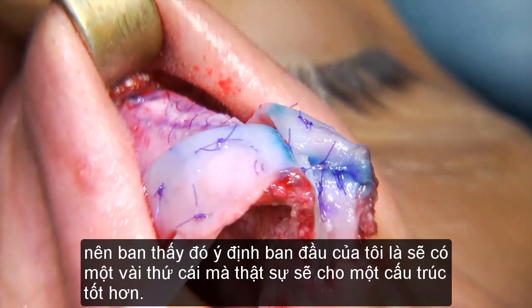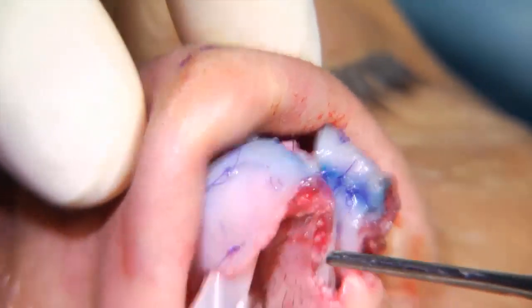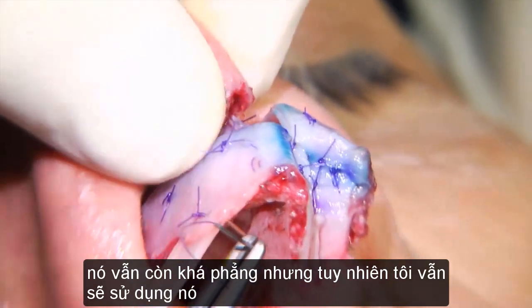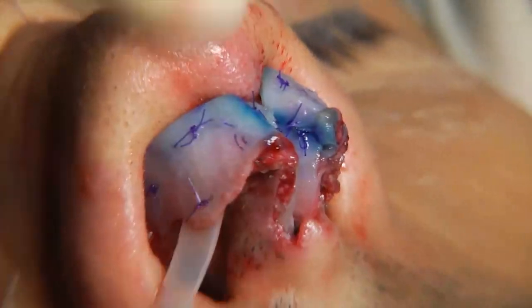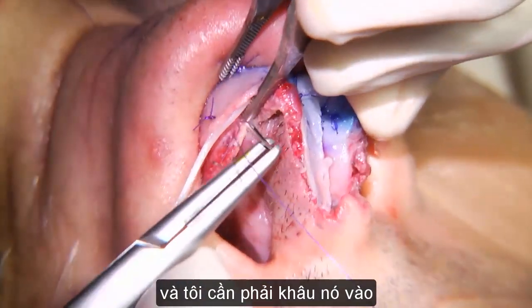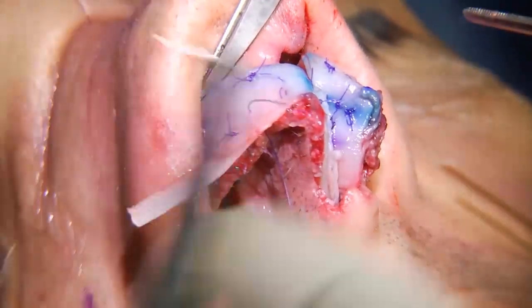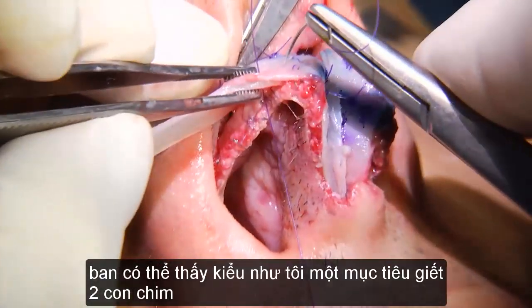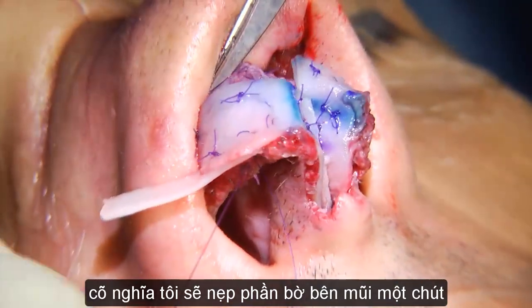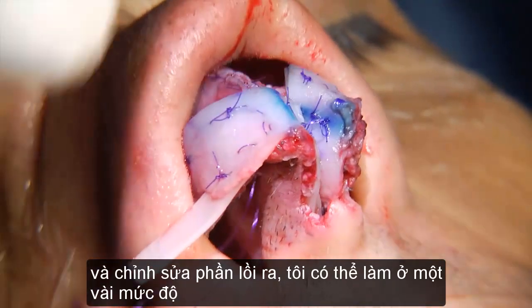So, my original intention was to have something which would actually give proper structuring. It will give me a little bit of structuring here. It's still a little bit flat, but I will just use it anyway. I know this is becoming a bit complicated, but you can see that I'm trying to kill two birds with one stone here, meaning I want to splint his sidewall a little bit and correct the convexity. I can do that to some degree.